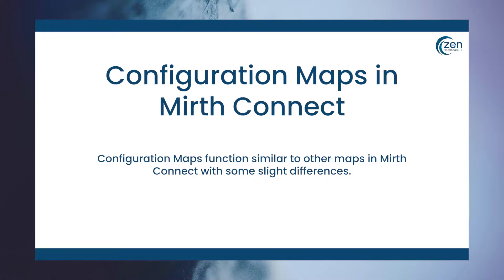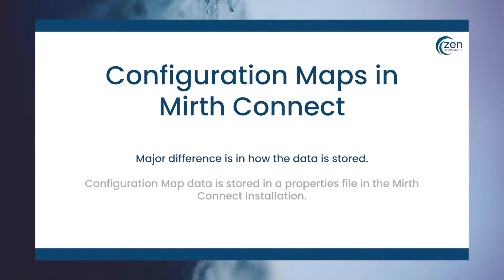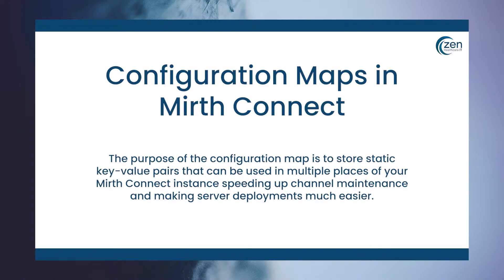The configuration map functions similar to other maps you may have worked with in MirthConnect, but with some slight differences. The major difference in the way configuration maps work is in how the data is stored. All other maps are stored in memory, while the configuration map's contents are stored in a properties file in the MirthConnect installation. This will be important to note in the event that you have to do some maintenance on the Mirth installation itself. The purpose of the configuration map is to store relatively static key-value pairs that can be used in multiple places of your MirthConnect instance.